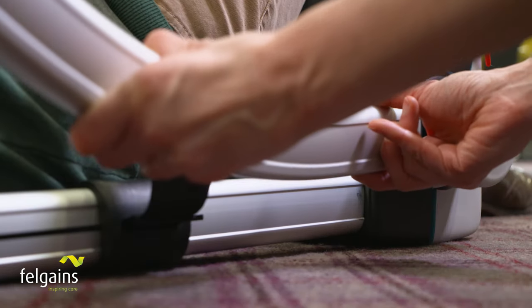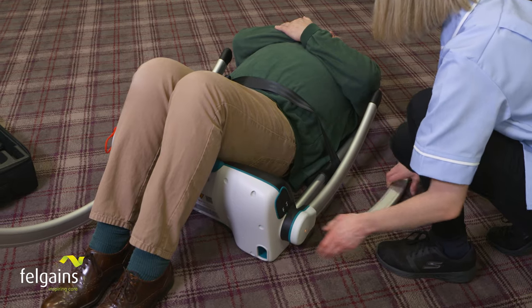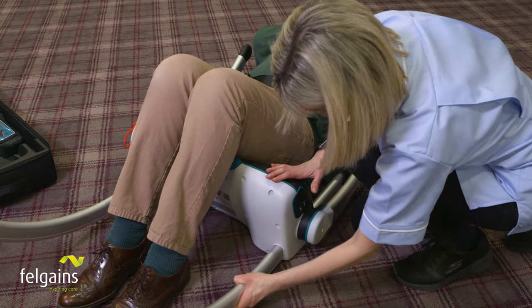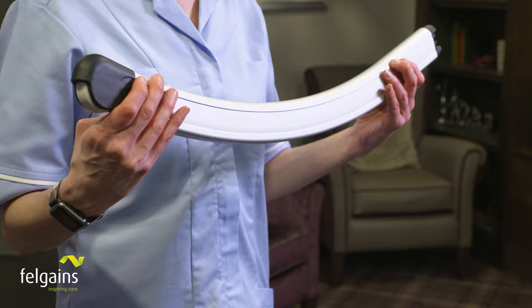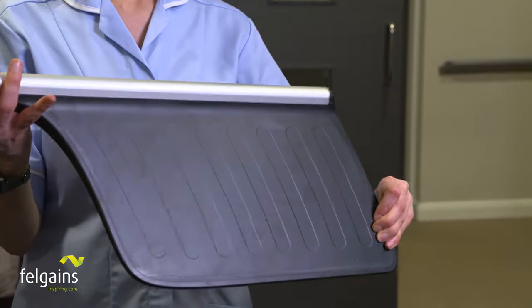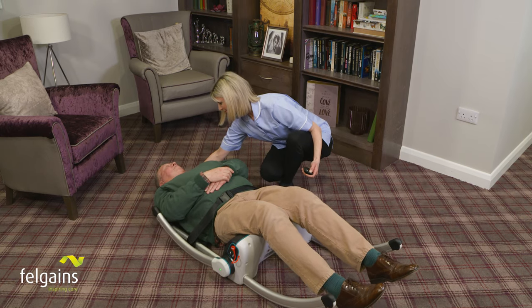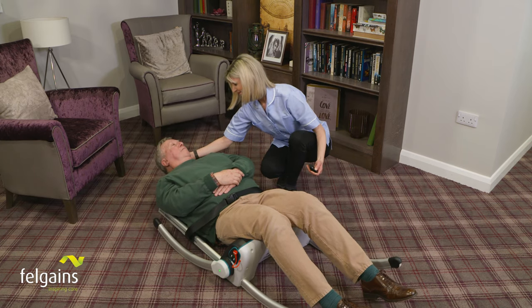The legs click into position like this and this, with a further sound when assembly is correctly completed. All the leg sections and backrests are identical, making the Razer 2 impossible to assemble incorrectly. This ensures excellent stability, giving both the caregiver and the fallen person total confidence.